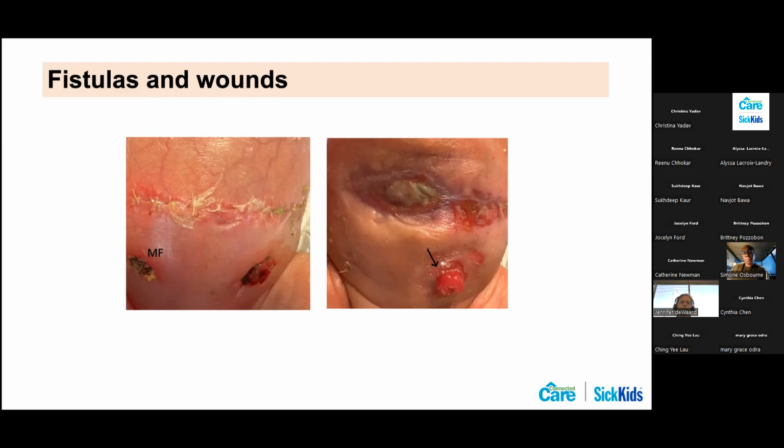So we really had to learn how to isolate the stoma from the wound to help reduce the bacteria in the wound and help the wound heal, and then minimize the skin injury that you can see. There's some skin stripping on the right there, superficial ulceration that came from having to change the bag so often. So for this patient, we just had to move to a much smaller ostomy appliance, similar to a neonatal urostomy pouch. We weren't as concerned about emptying the pouch because the output was not as much, but we really needed something a lot smaller to isolate the stoma from the wound.